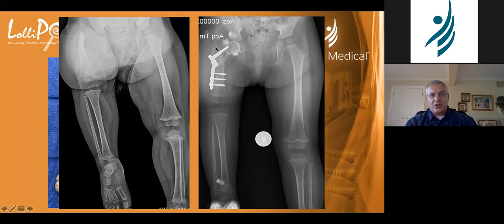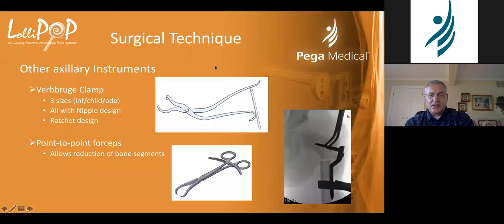All of this is cartilage. You can't see anything, and all this is going to fill in over time. You can see how strong the plate is. It's sitting off a little bit. You can chisel away the little knuckle. You don't have to. As long as it's sitting in well, it'll do fine. And if you look, this was the previous design. That knuckle is now gone. This comes straight down.